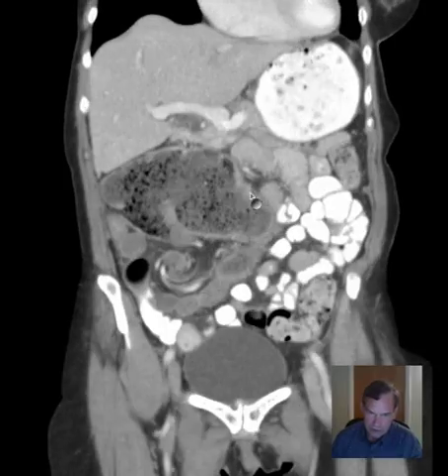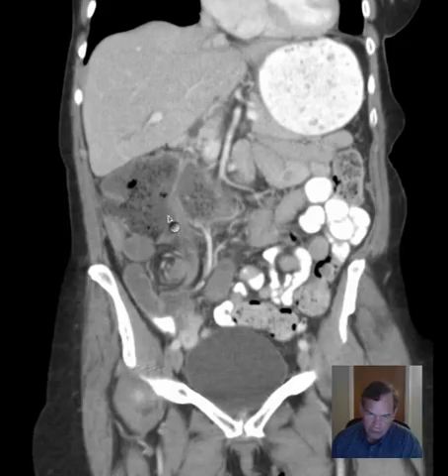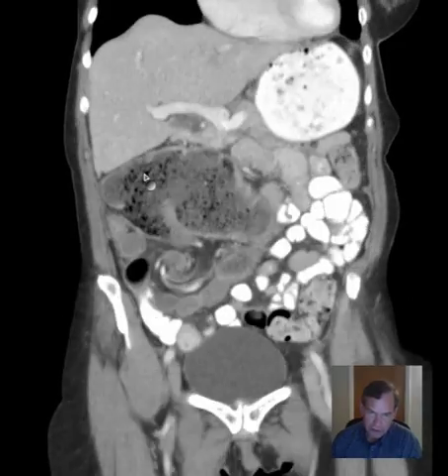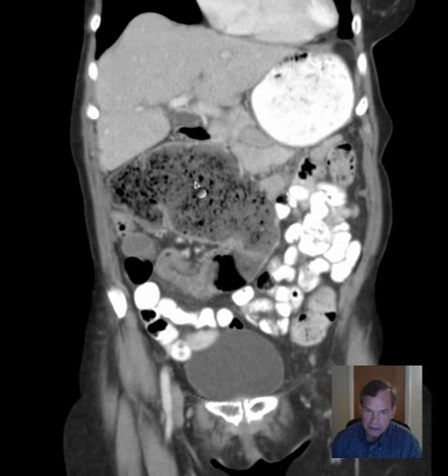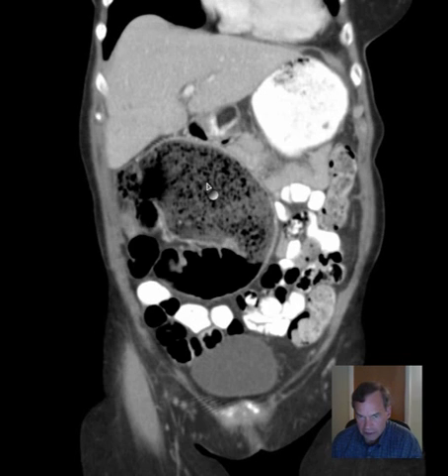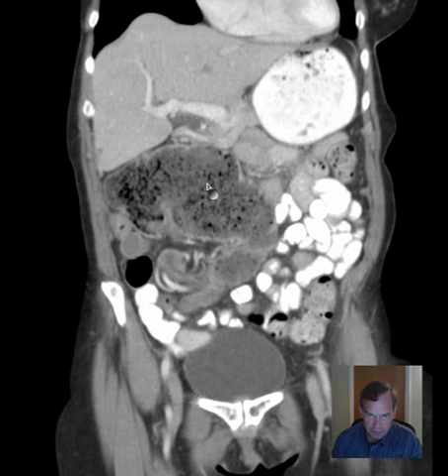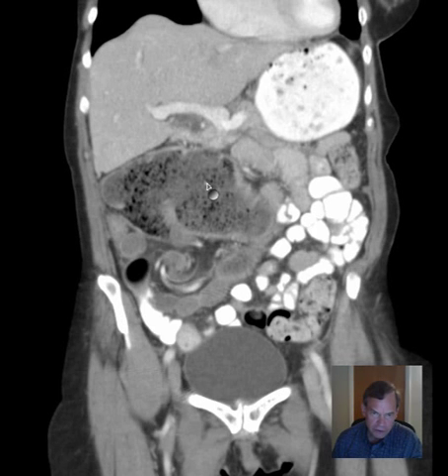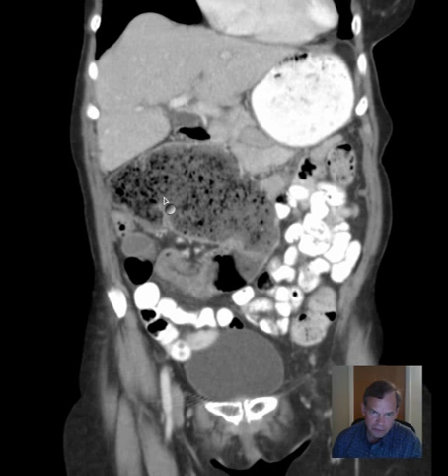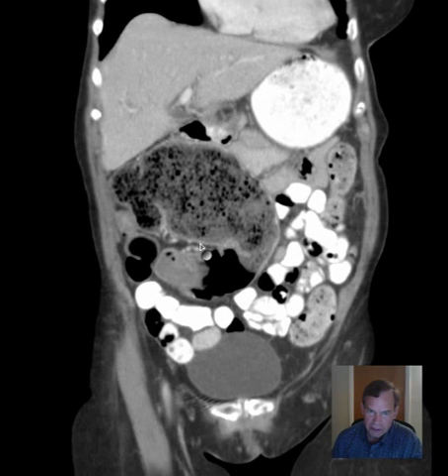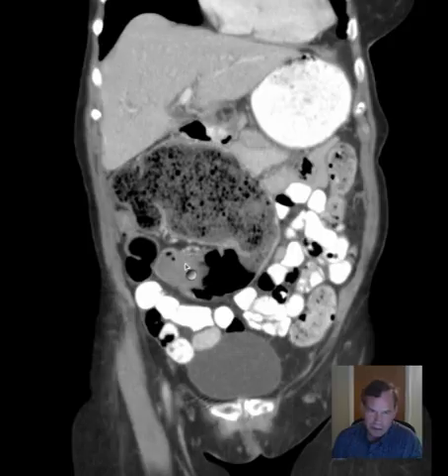This looks like it could be the cecum flipped up — kind of flipped up superiorly. And this is all stool and debris in that dilated cecum. That's my proposal here. There's a little cleavage plane that looks like it could be where the ileocecal valve might be. It looks like this is cecum that has flipped upward into the right upper quadrant.